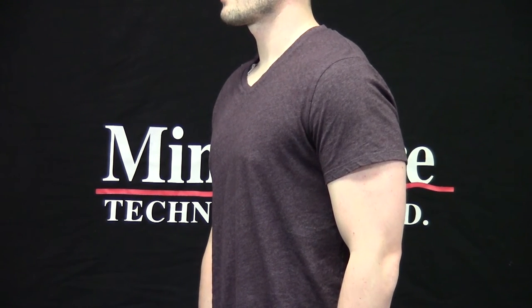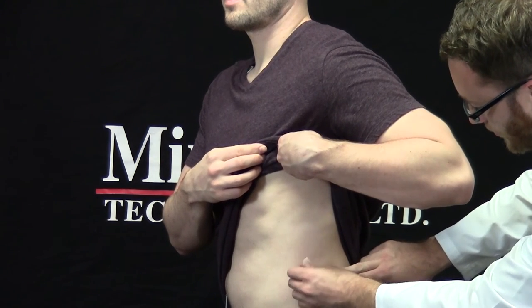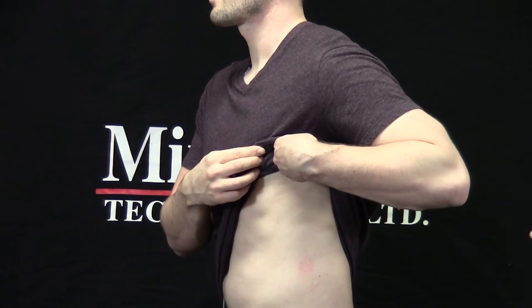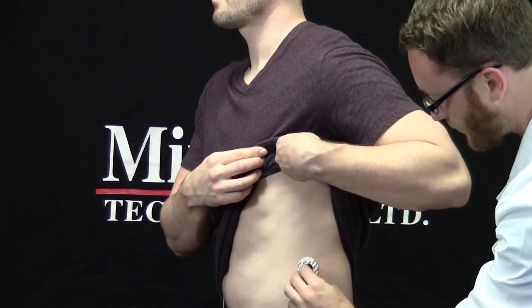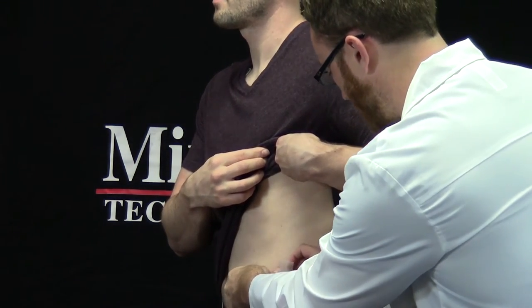I'm now going to repeat this process for the second ECG lead, which is placed across the body on the left bottom rib. I'll ask the subject to lift their shirt above their stomach. I'm going to use my fingers to locate the bottom rib and clean the site with the alcohol prep pad. Once again, I'm going to take an electrode off the strip, again with a brown lead wire attached, and place it on the site I've just cleaned. And finally, like before, I'm going to create a tension loop using micropore tape.